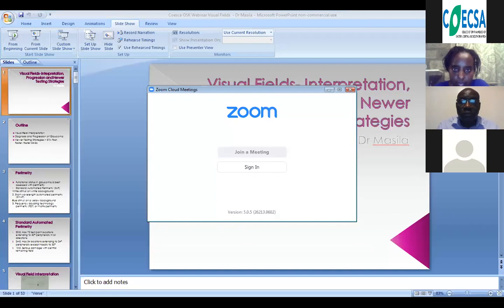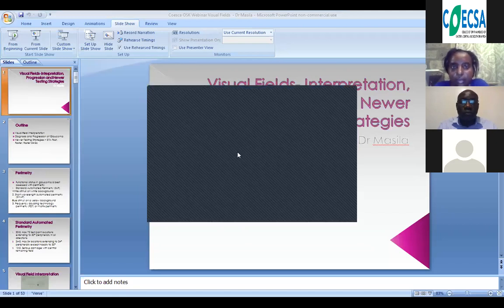It would be interesting to know what spot sizes she's referring to, because for the Goldman, there are different spot sizes and different light intensities. As you had said earlier, Dan, different countries have different recommendations for both their pilots and their drivers.